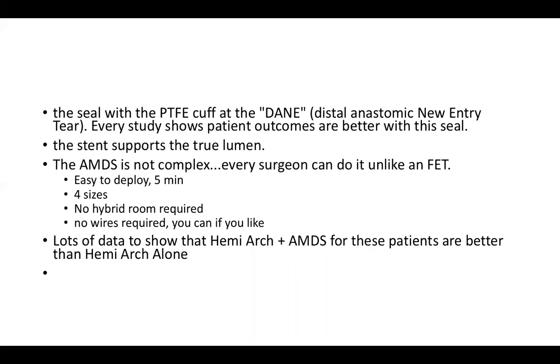Yeah, that's right. If you haven't resected the entry tear, then the uncovered nature of this stent wouldn't necessarily promote remodeling. You need to remove that. That's still that principle of removing that. So I don't think it would help in that scenario, and I think it wouldn't be right to use it. I think that was one of the reasons, right?